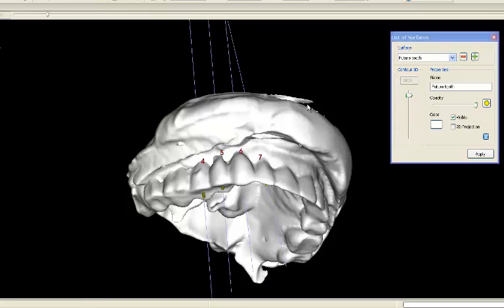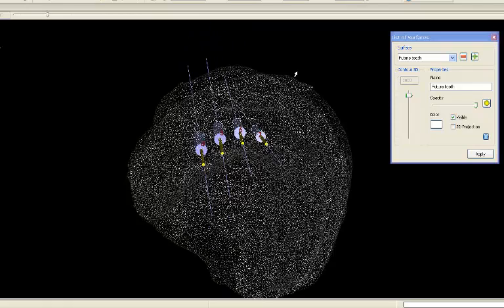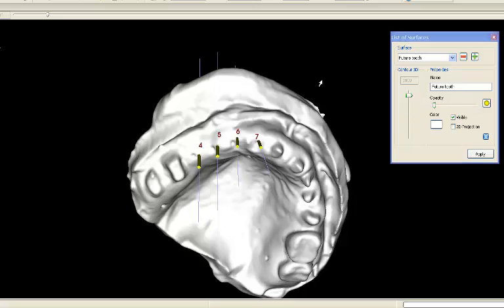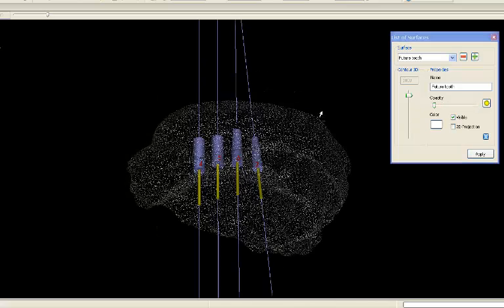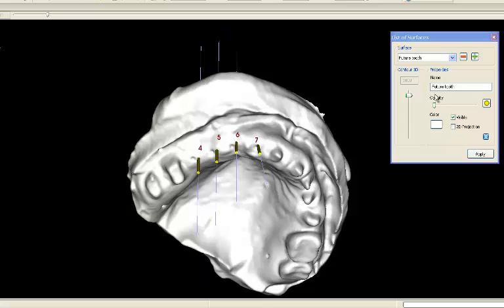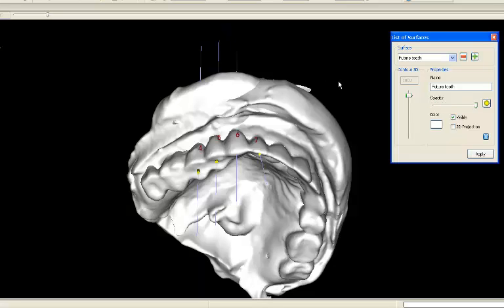In this example, future tooth position can be determined from a temporary bridge. This is a temporary bridge that the patient is already wearing and it can be used to determine future tooth position for implant planning purposes.